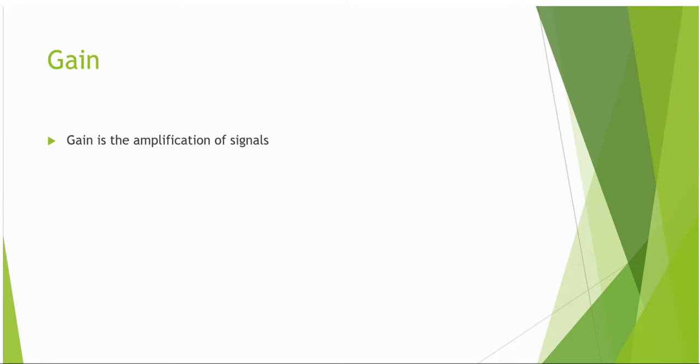Gain. Gain in its simplest sense can be considered as amplification. Reflections from the body are returned to the ultrasound probe and the signal is then dialed to the desired level. You can consider the gain dial to be more like the volume control on your radio. Turn up the volume and the music gets louder, a fairly simple concept.